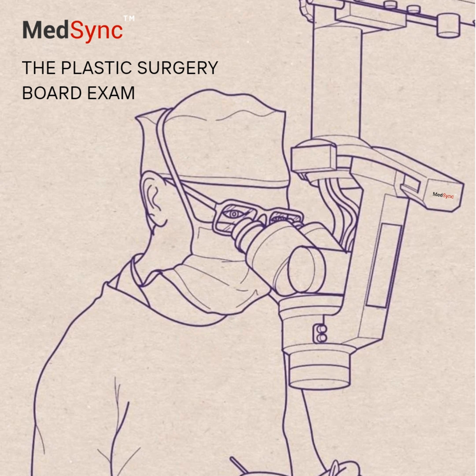Diabetic foot disease. Seems like a prime indication. Absolutely. Strong evidence here. Facilitates healing by secondary intention, reduces wound surface area, that's level I evidence. It's safe and generally more effective than standard dressings for healing ulcers, reducing time to closure, and potentially lowering amputation rates, often used as a bridge to definitive surgical closure or grafting, too.